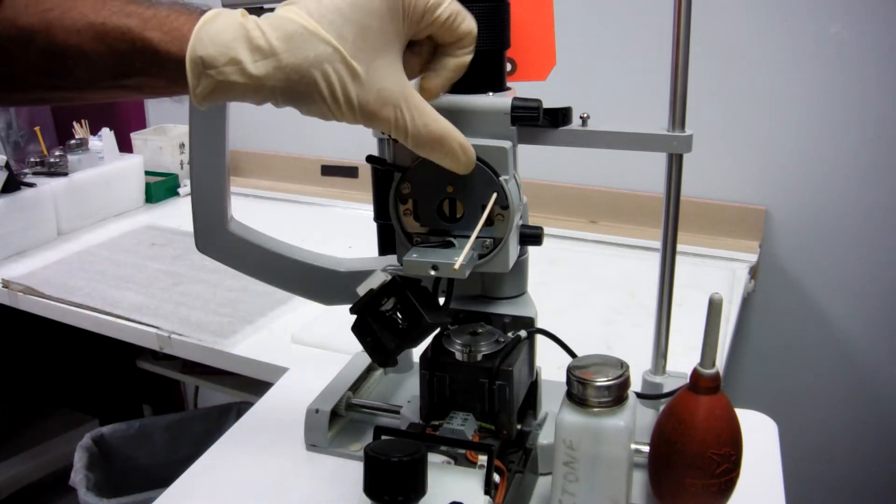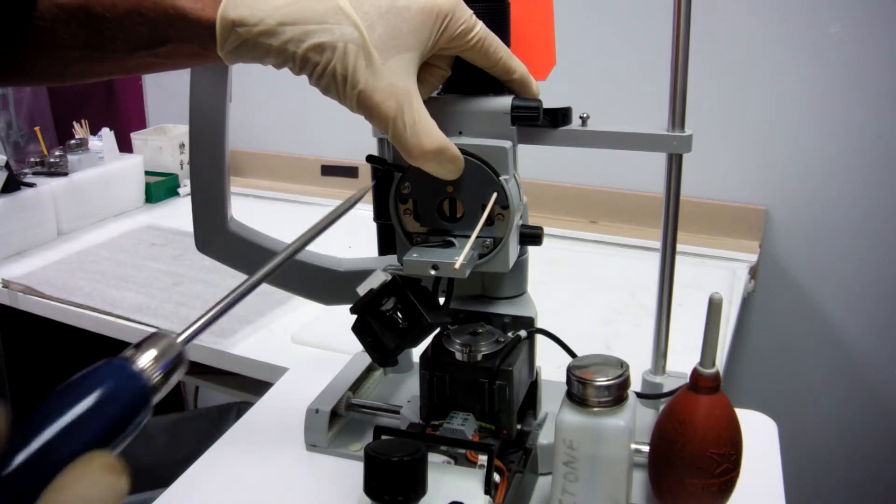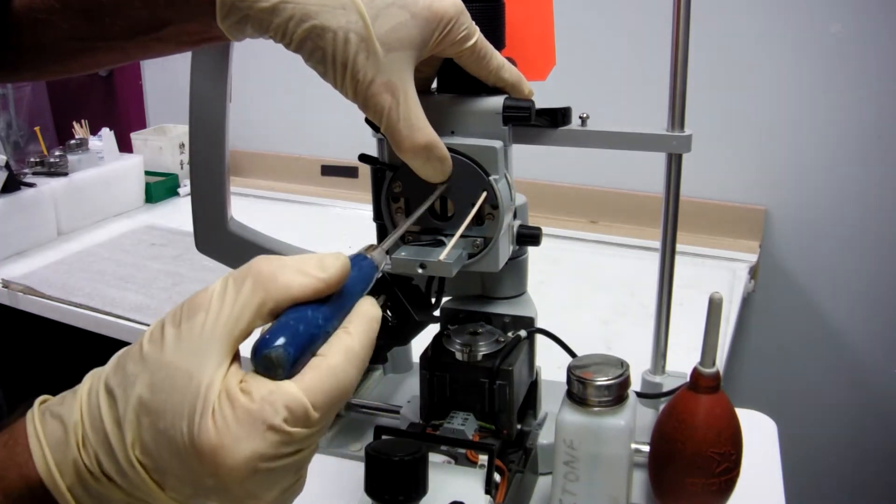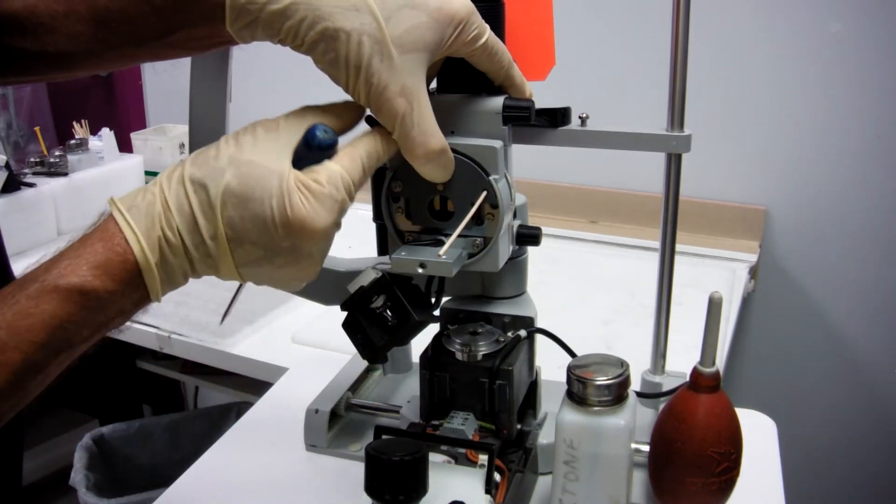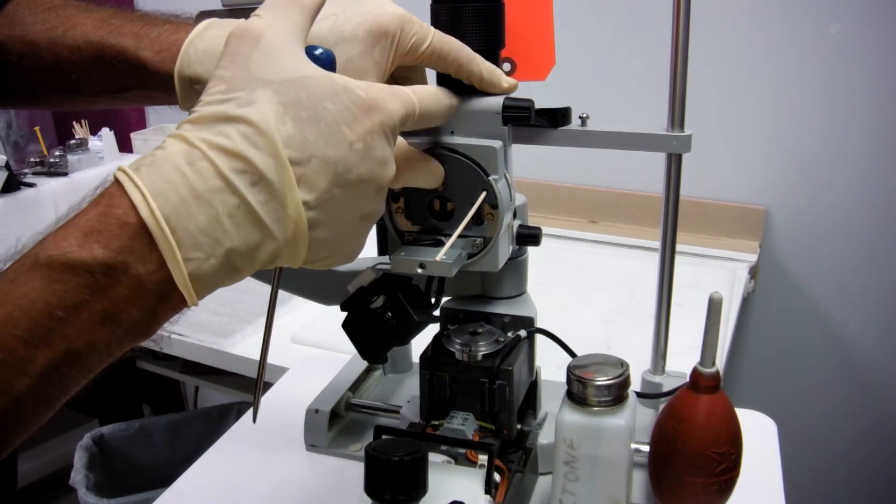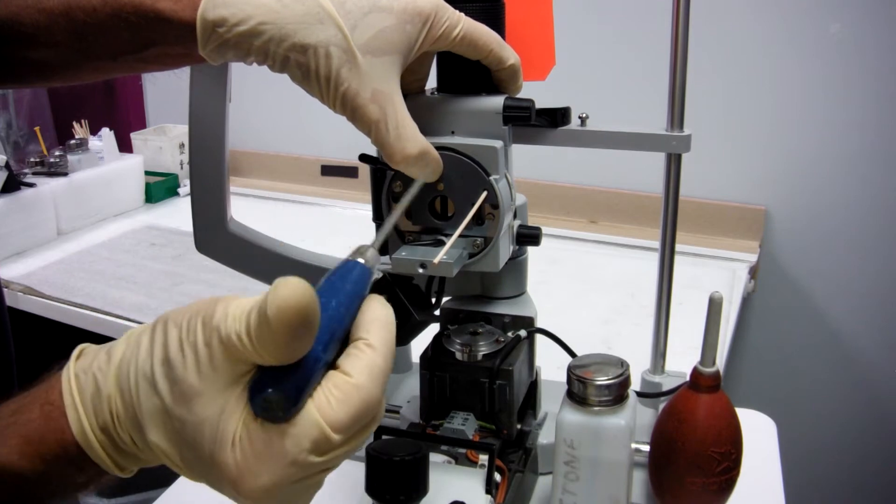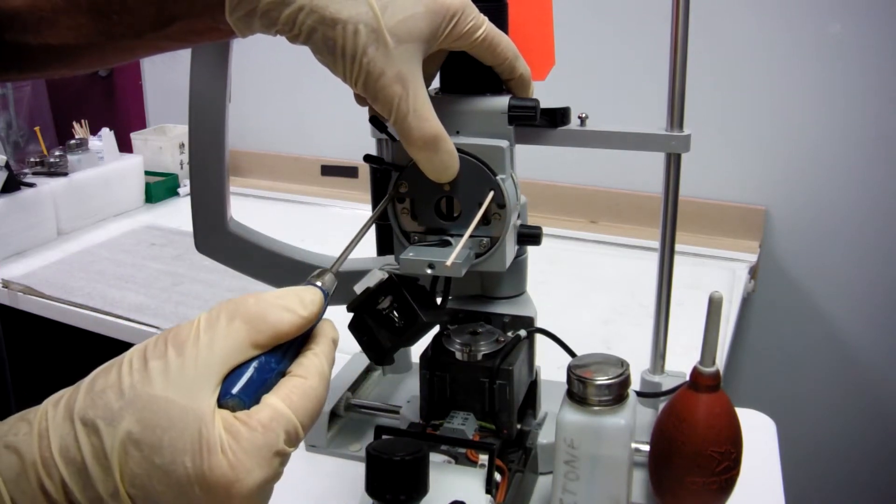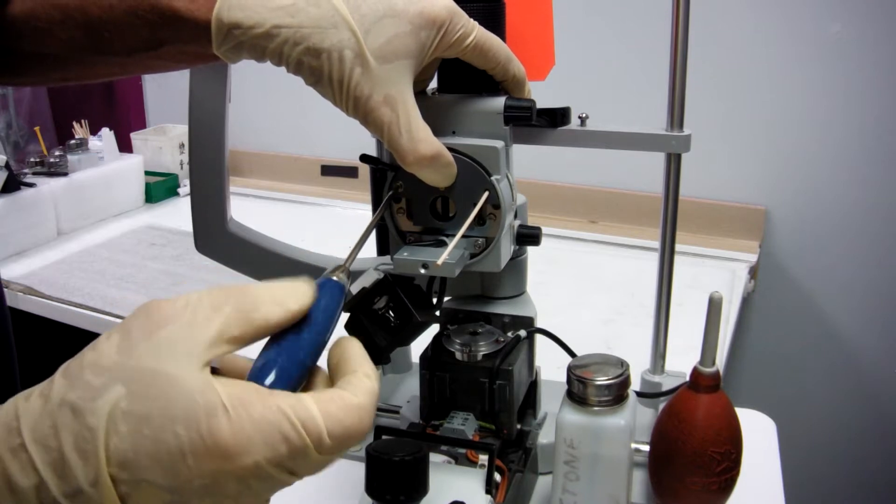Keep pressure on the assembly with your thumb because there's a bearing behind here that has a detent. There's a bearing, a spring and a bearing behind here. So I'm going to keep pressure on it while I loosen this side.